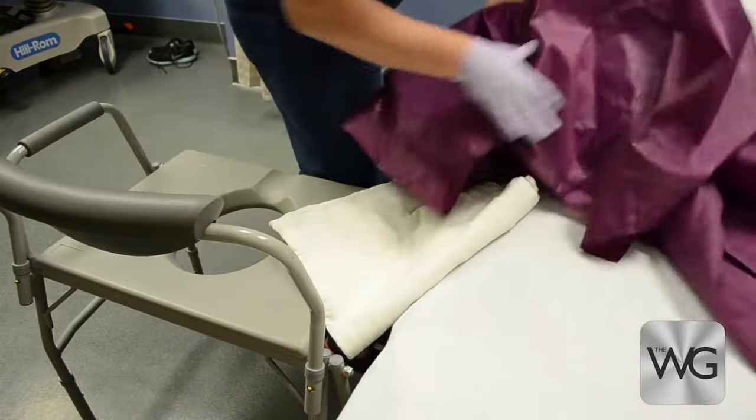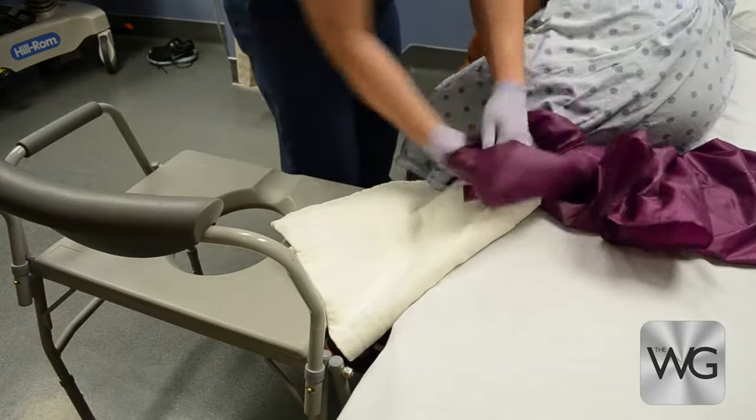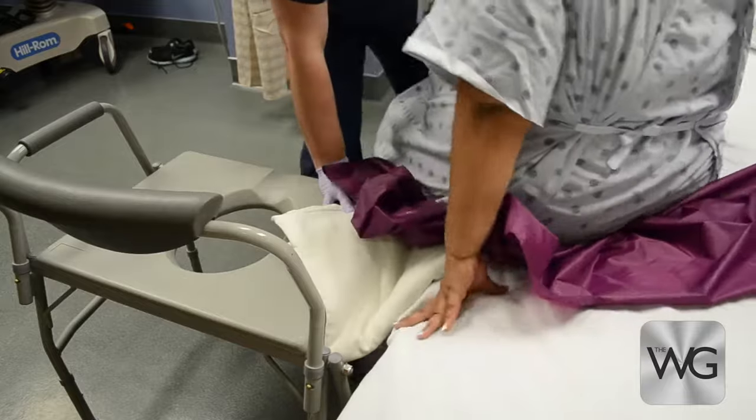Instruct the patient to slowly scoot her bottom on the slide sheet toward the edge of the mattress near the commode. Instruct the patient to lean forward as she scoots toward the commode. Do not allow the patient to lean back while seated on a slide sheet.